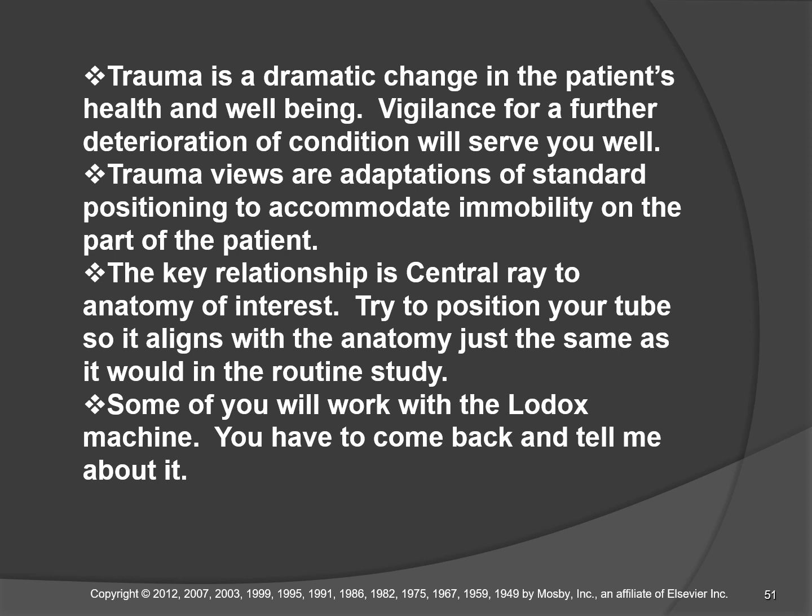It might be, because it was such an awful unitasker, you might not see it outside of a military application, but some trauma hospital somewhere has invested in that thing. So hopefully you find one and you email me back or come back and tell me how it was to shoot the Lodox machine, the AP and lateral in 20 seconds. Full body AP and lateral. It is an impressive machine.